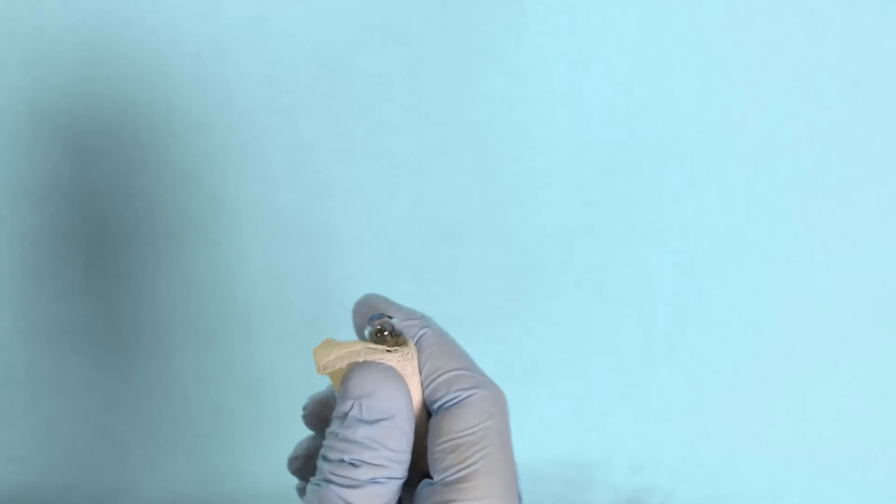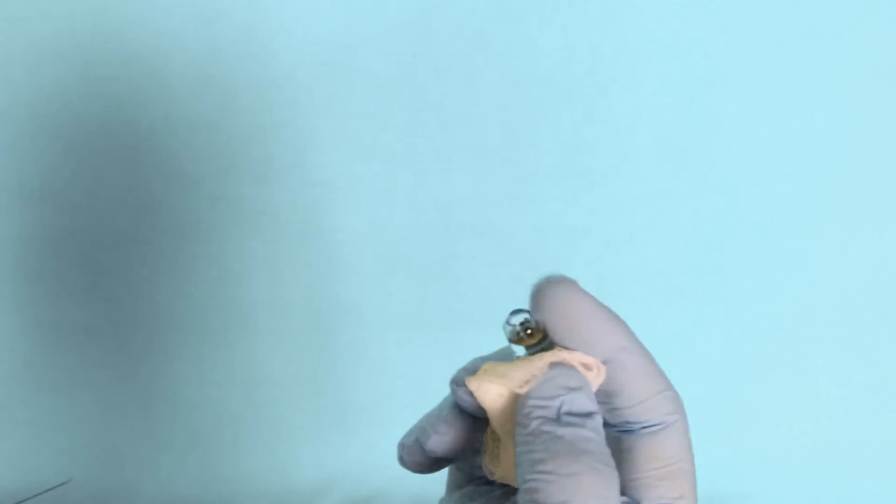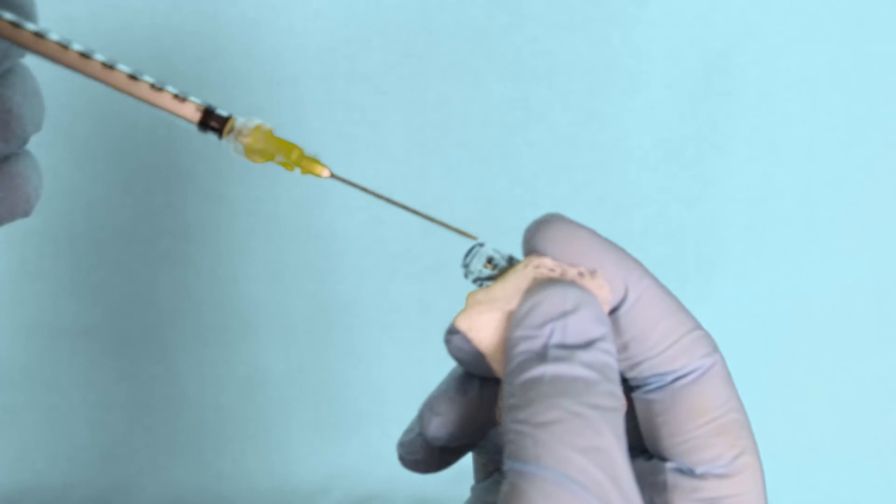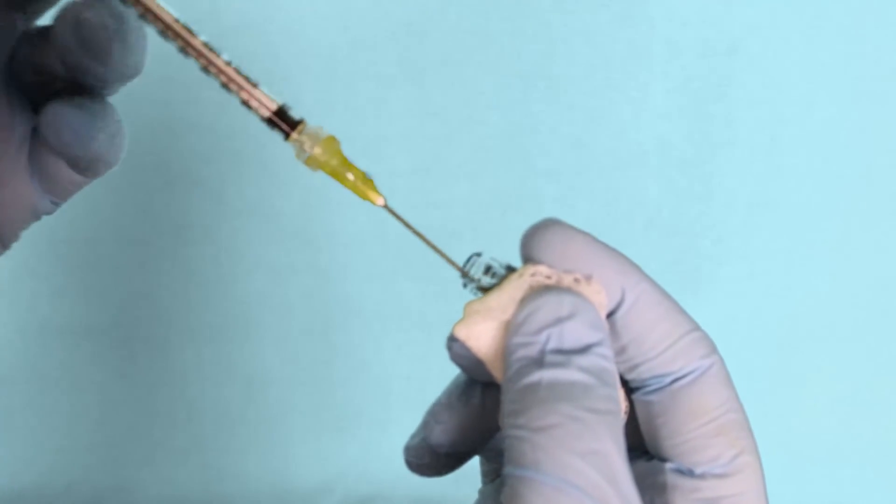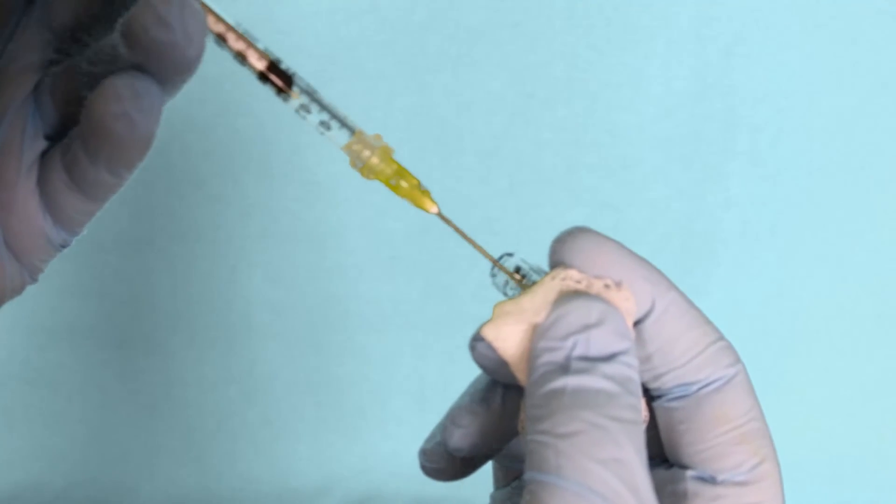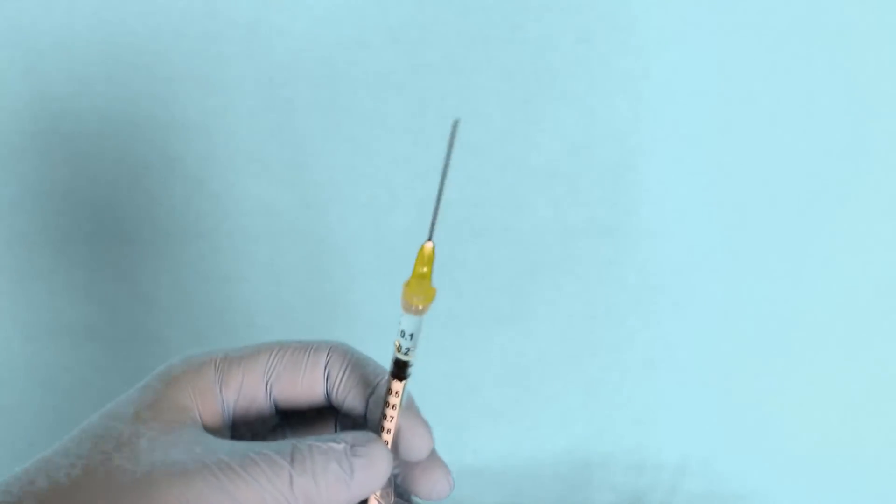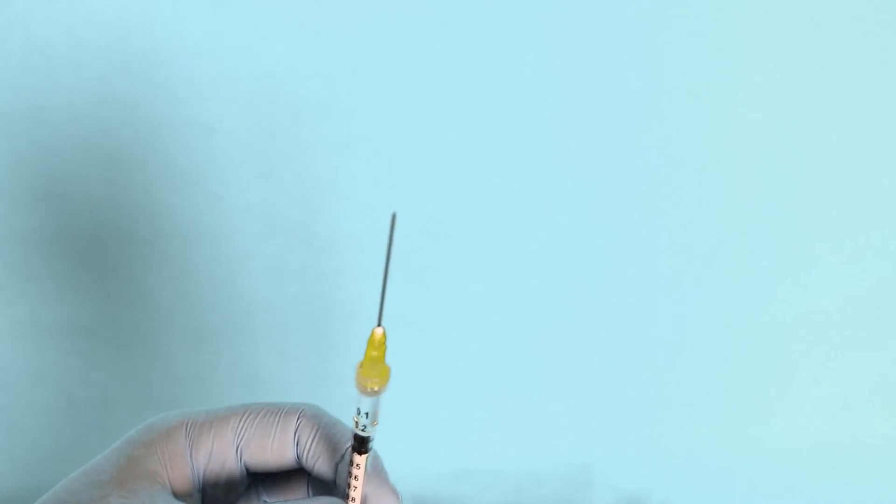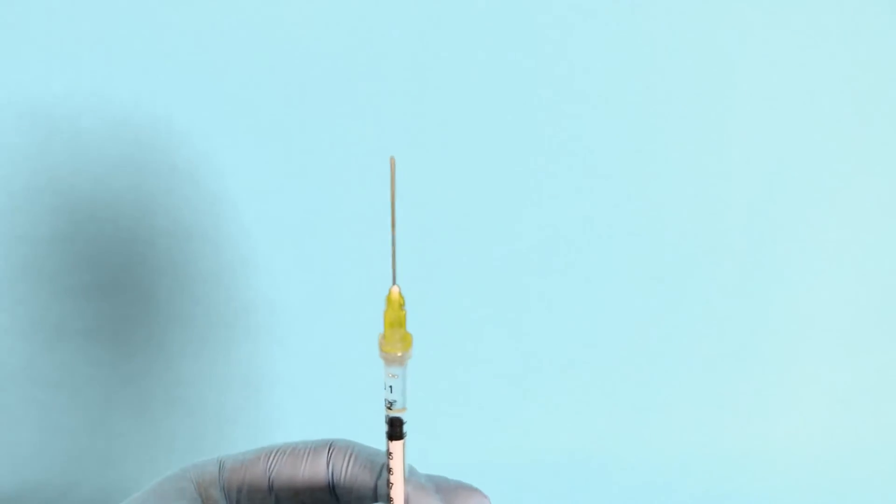Then, taking one of the syringes from your emergency medical kit, draw up the contents of the ampoule by holding the ampoule relatively horizontal to the ground. We then express any air bubbles from the syringe by holding it vertically. We then inject the appropriate dose for the age and weight of the patient into the outer thigh.